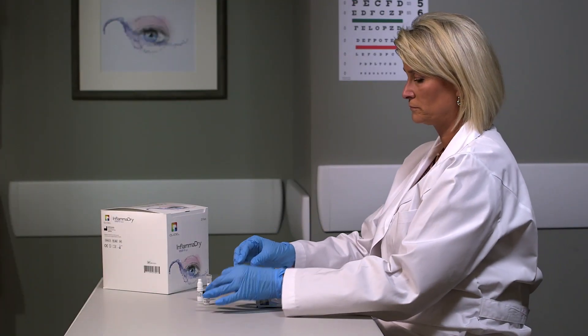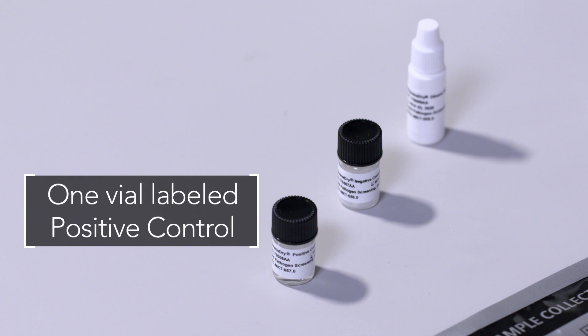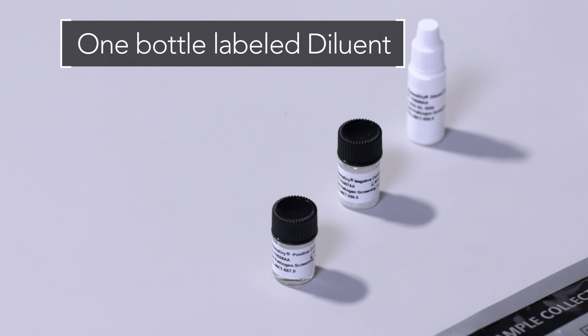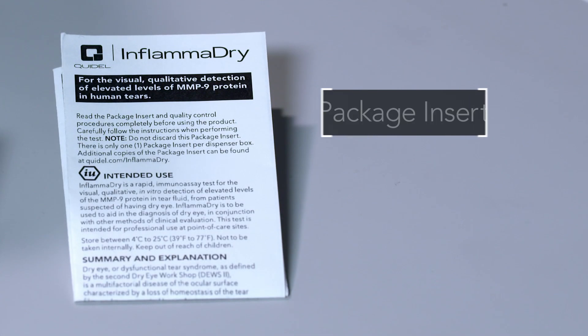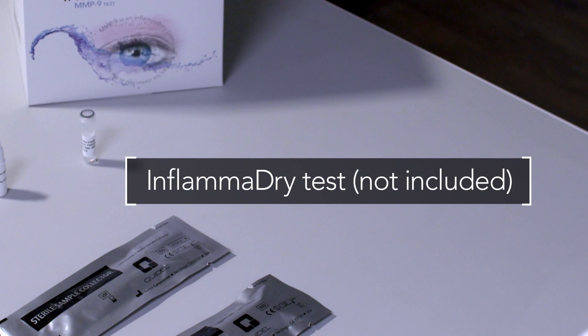The InflammaDry external controls contain one vial labeled positive control, one vial labeled negative control, one bottle labeled diluent, and a package insert. You will also need an unused InflammaDry test to run the controls.